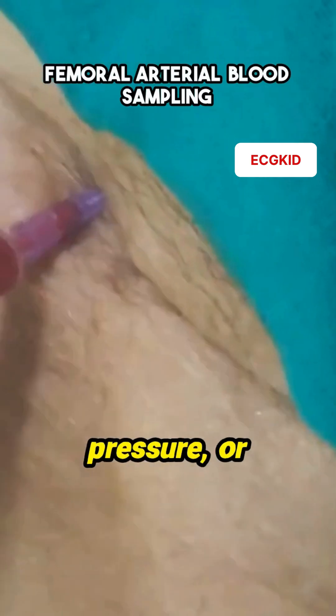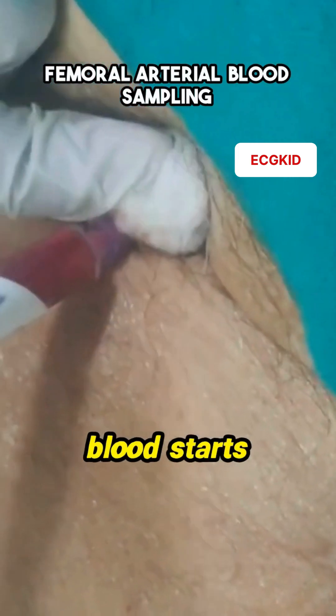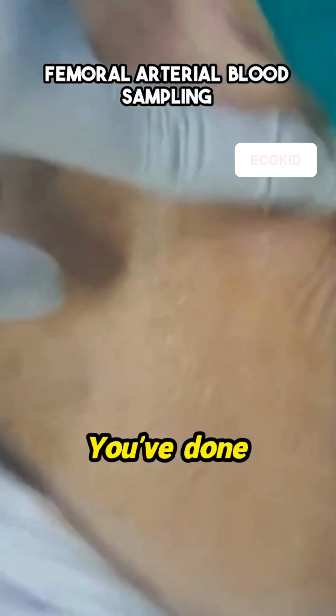Next, we aspirate with gentle pressure — or, you know, not so gentle. Just get it done. Once the blood starts filling the syringe, that's it. Congratulations, you've done it.